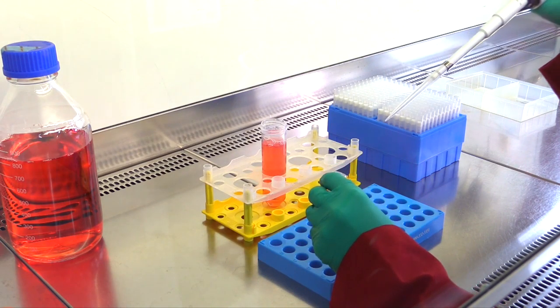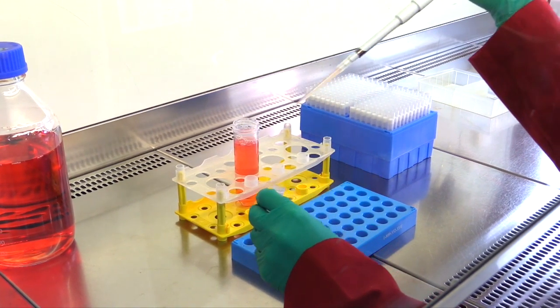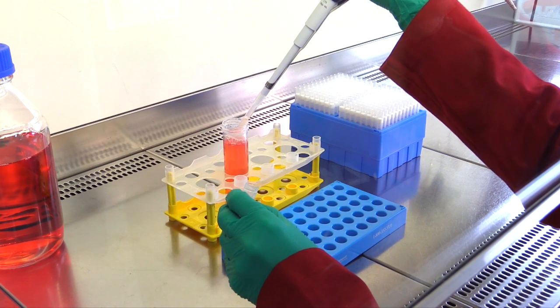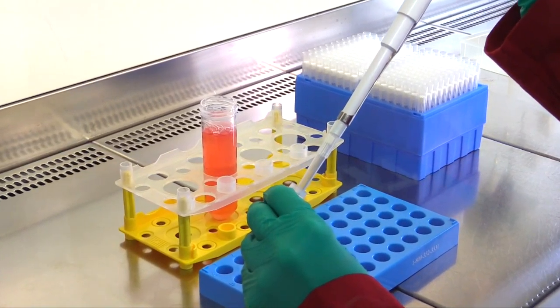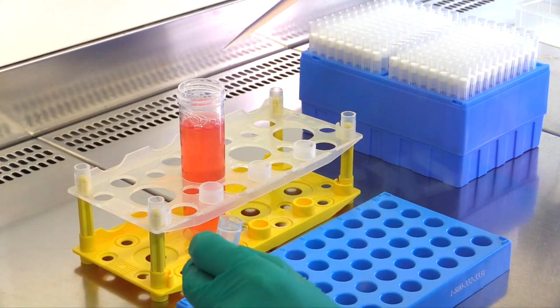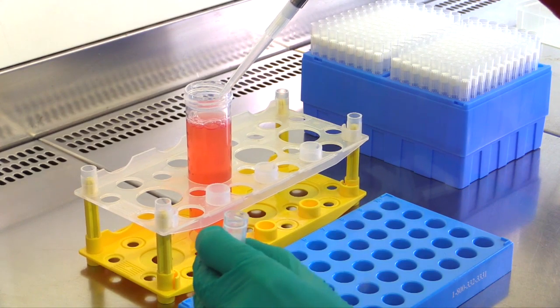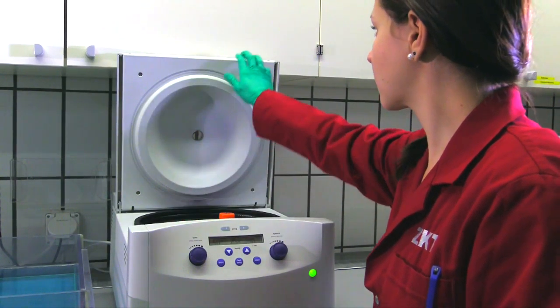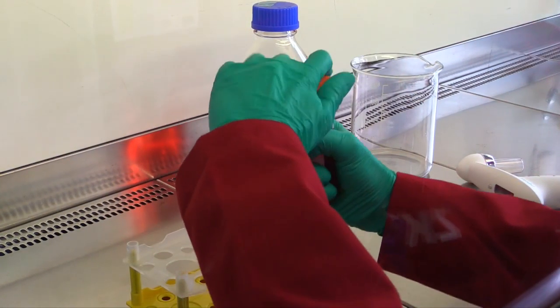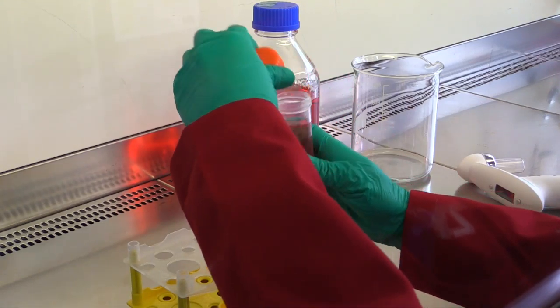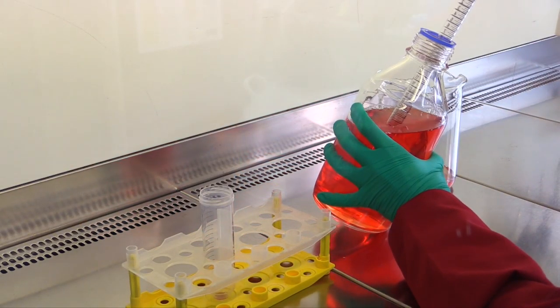In the laminar flow bench, the cells are transferred into preheated medium to dilute the toxic anti-freezing compound which is contained in the freezing medium. The tubes are centrifuged for 5 minutes at 1000g and the supernatant is removed. Resuspension in fresh culture medium then takes place.